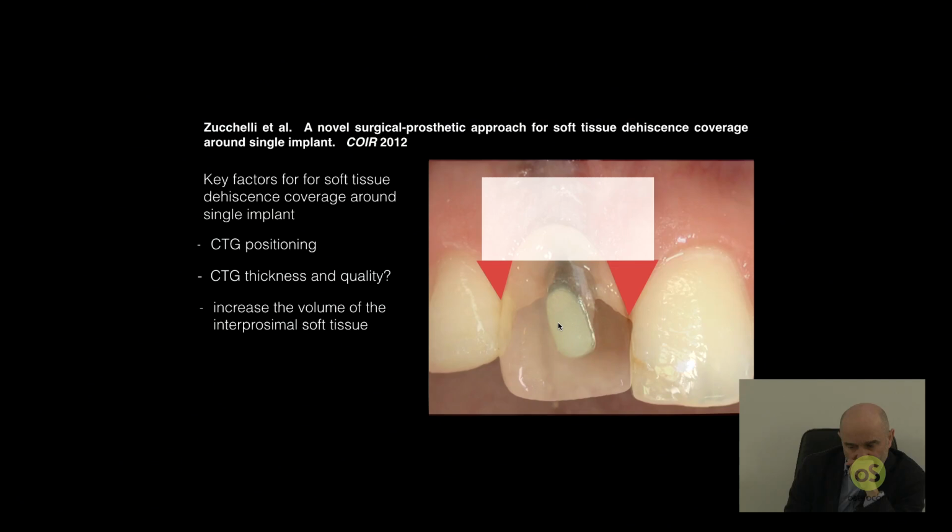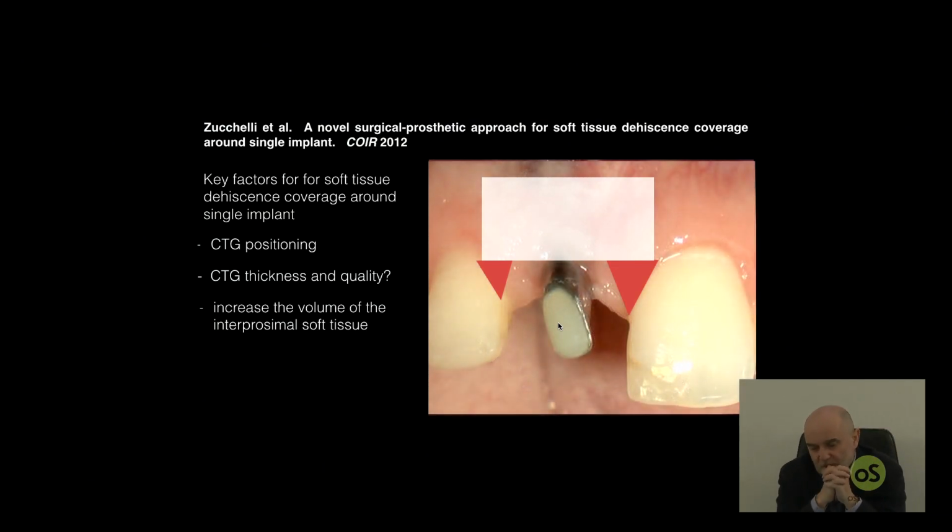And with time, you will see that the whole area, which was previously occupied by the crown and by the old abutment, is now filled by a very dense, collagen-rich, mature connective tissue, which allows me to make the surgical procedure with trapezoidal surgical papilla and no more with triangular.